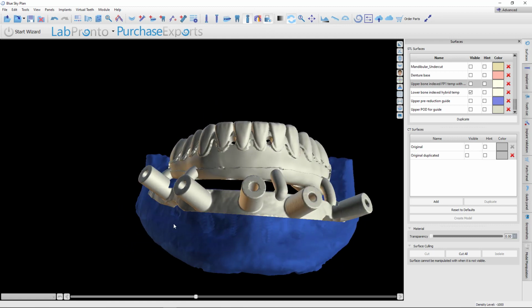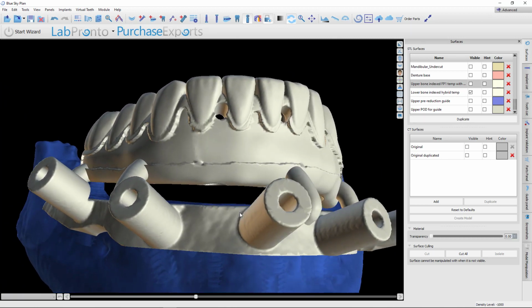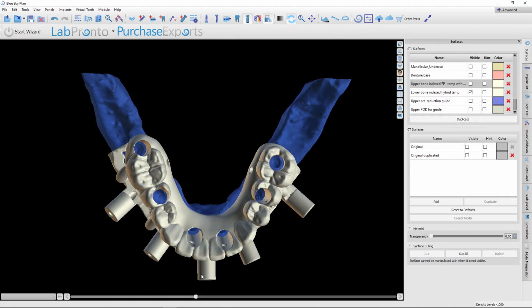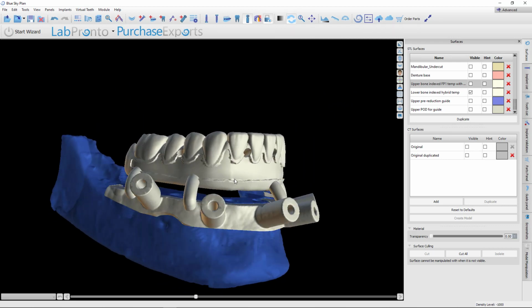Once the cylinder is picked up, then you can cut off these, and now you have an almost finished hybrid that is pre-designed to be smooth and ovate on the underside. It sits exactly 3 millimeters off of the new height of bone, so you know you're not going to get angry tissue because you're impinging too deep or anything like that. The reason you're seeing this is just some gingival cutback. I like to make these monolithic. We typically print these out of Vigo permanent crown and bridge resin because it's super, super strong, but it's monochromatic. So we'll go back in and add some gingiva into this cutback that I've done.